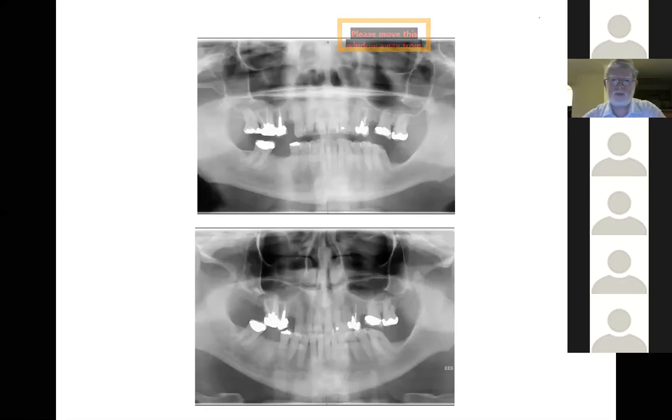Okay, there we go. So the answers we're getting with regards to the question is 1, 7. Fantastic, Bob. Yeah, within oroantral communication. So this happened with one of the dentists in our practice.